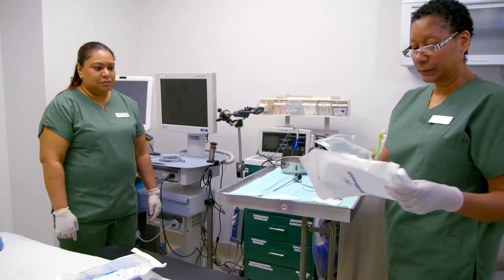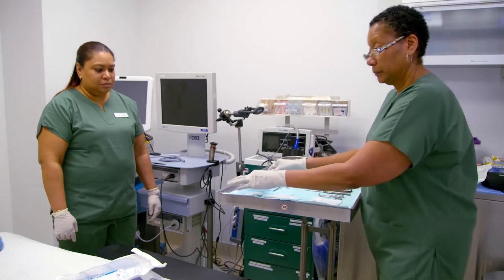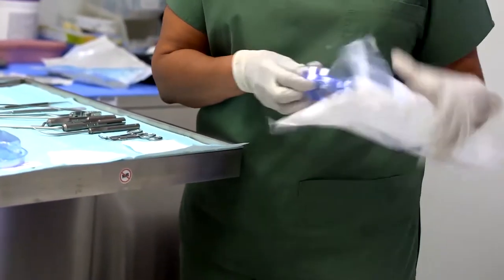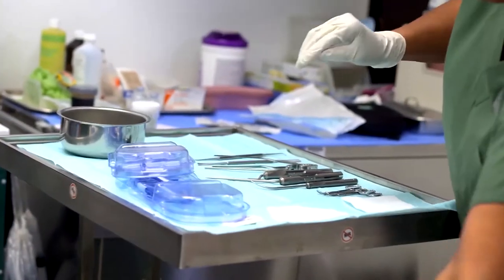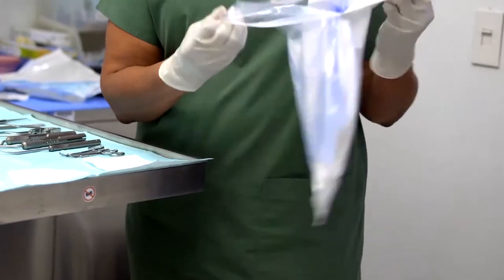And my balloons. This is a frontal. Maxillary. And a sphenoid.